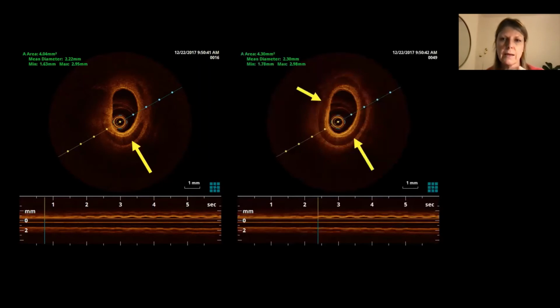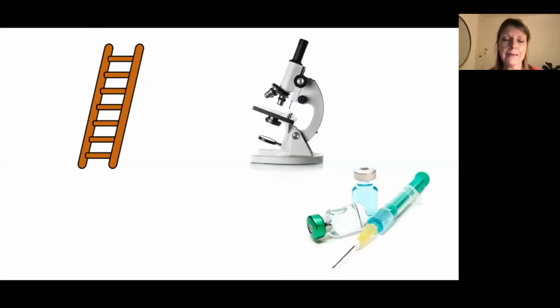In this patient, can I convince you that the cartilage ring goes all the way around, and these complete cartilage rings are what cause long segment tracheal stenosis. The surgeons need to go in there and find every single ring and divide it, and us being able to do this procedure down through the trachea for them allows them to map exactly which bit of the trachea needs operating on. It's really exciting stuff and really innovative.